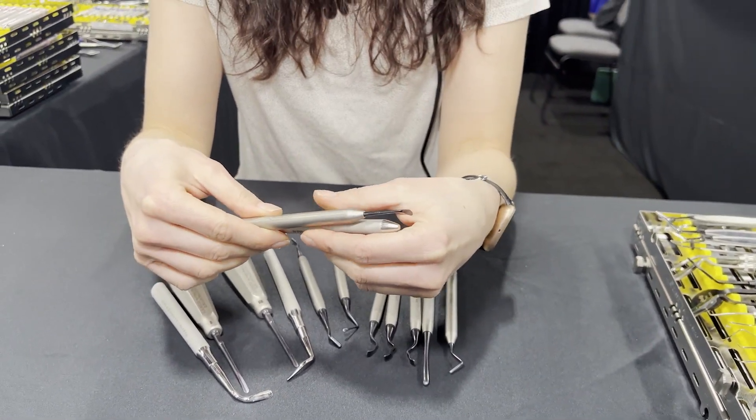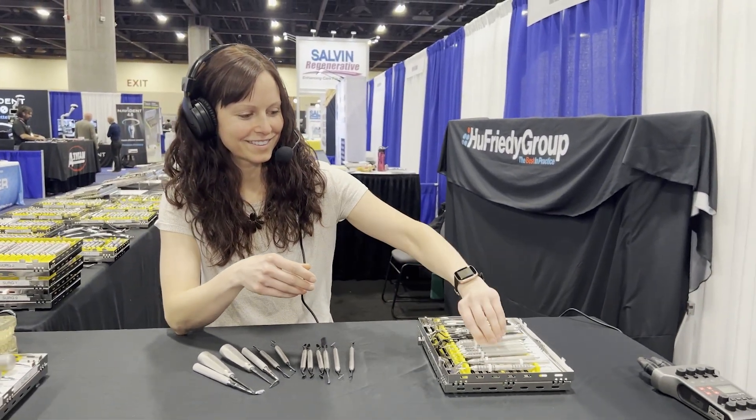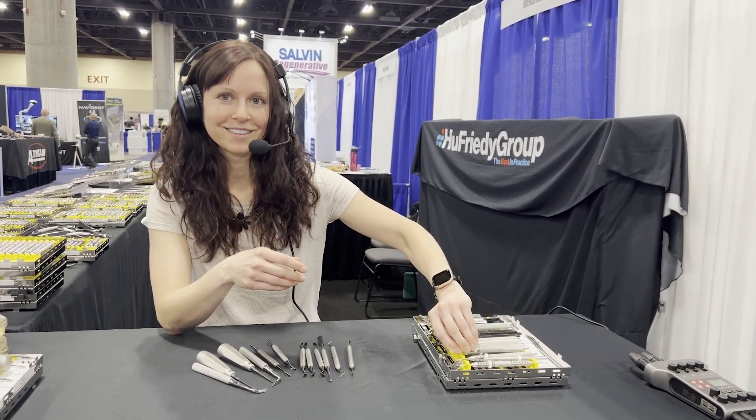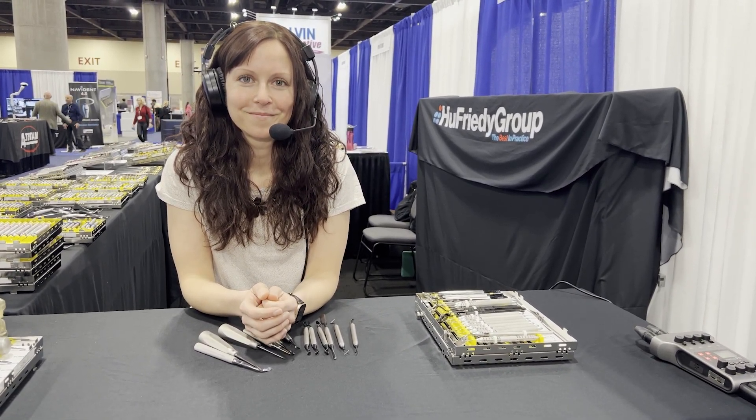So if you're interested in this, this is the Hu-Friedy booth here at AO. Talk to your Hu-Friedy rep and get on board with these black ones — save your eyes for longevity. This has been another episode of Implants Made Simple. I'm Dr. Robert Stanley, Smile Engineer, out.